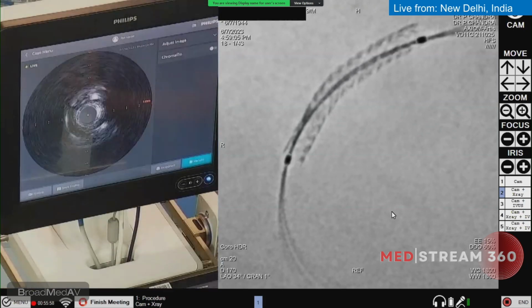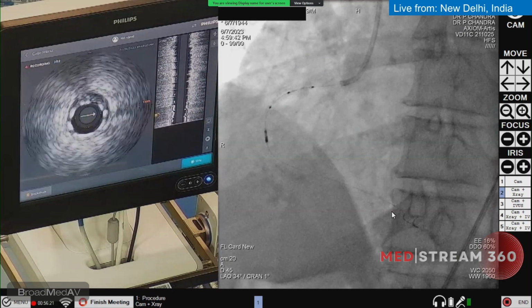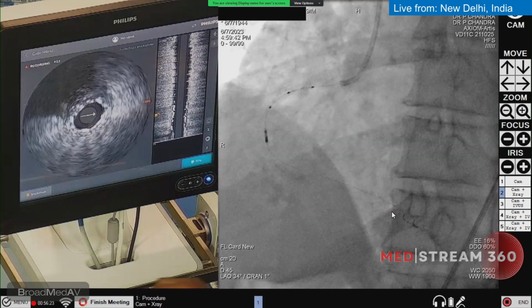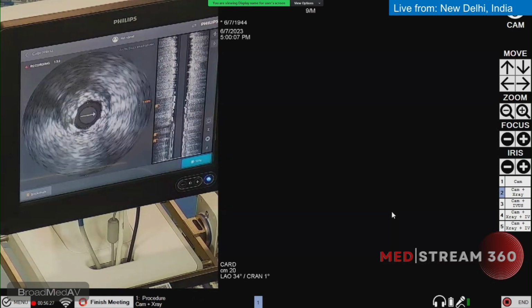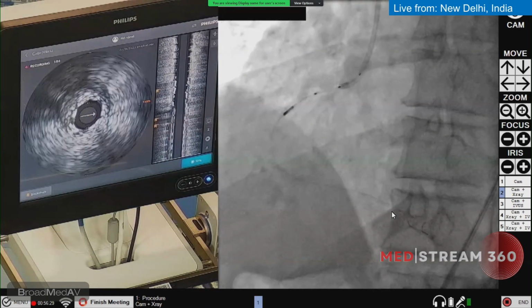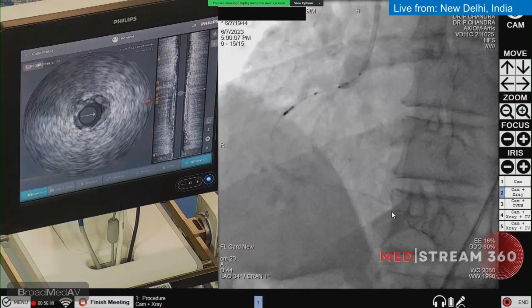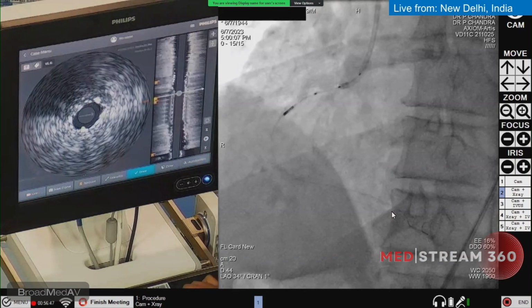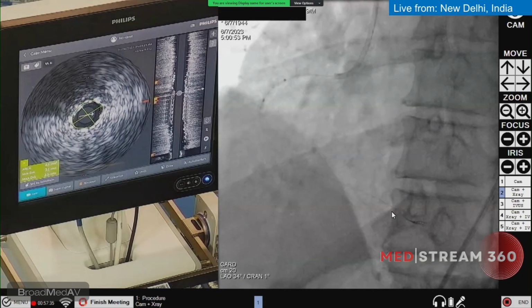The hemodynamics is okay. The ECG is okay. Stent is absolutely perfect. Distal edge is fine. Here it needs some more expansion. You see, this is the place where it needs more expansion, where the tight lesion was. And then proximally it is okay. So the proximal and distal edges are absolutely fine. And the middle, I will go with high pressures. So I will do some stent boosting.